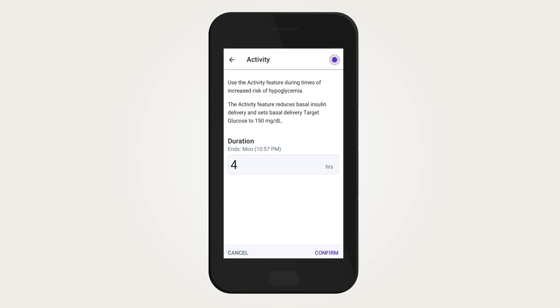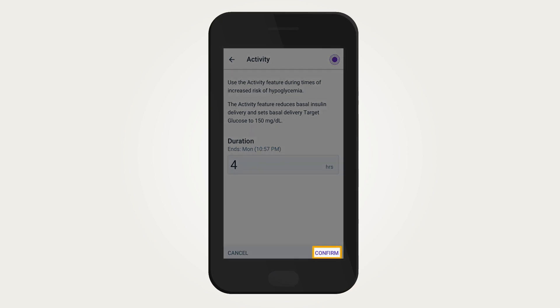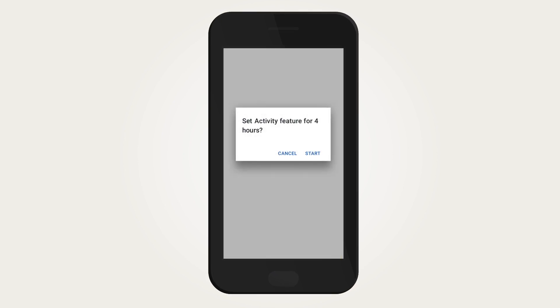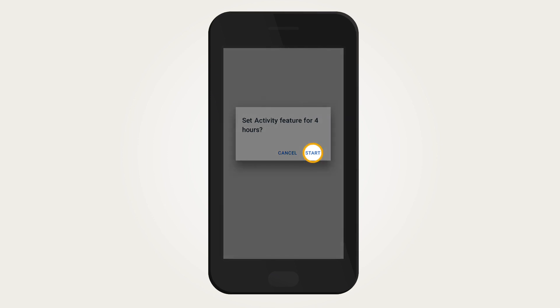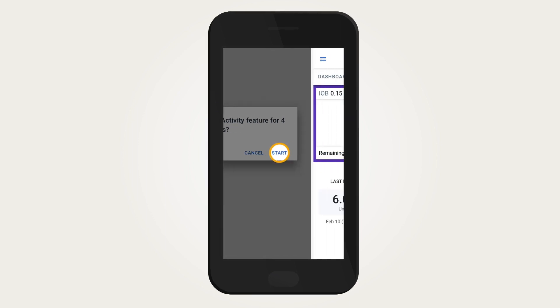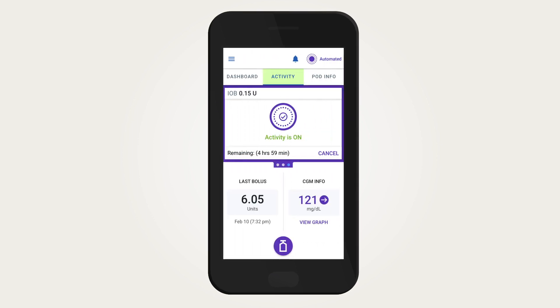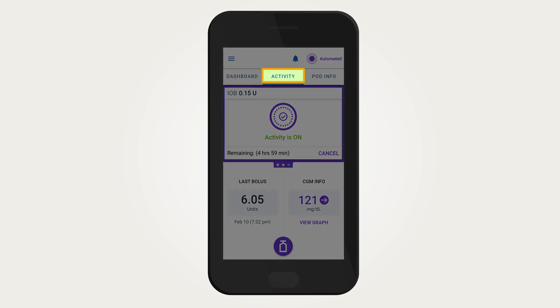Review the duration entered. Tap Confirm. Tap Start from the Confirmation screen. The Home screen will indicate that the activity feature is active by displaying Activity in green.